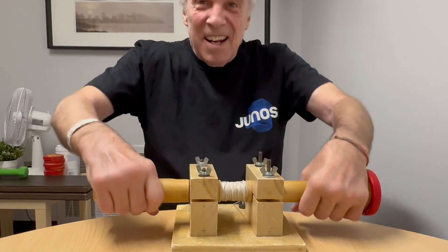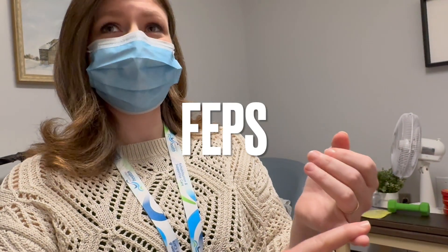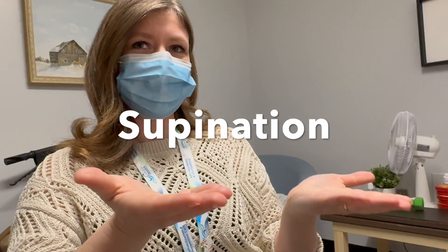What's the device called? Do you know what it's called, Mike? No. We call this the FEPS, which stands for flexion, extension, pronation, and supination. So — flexion, extension, pronation, supination.